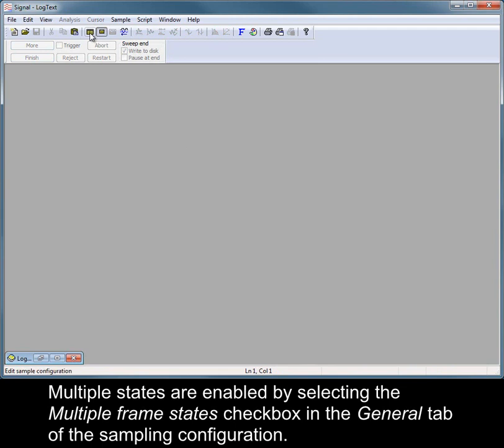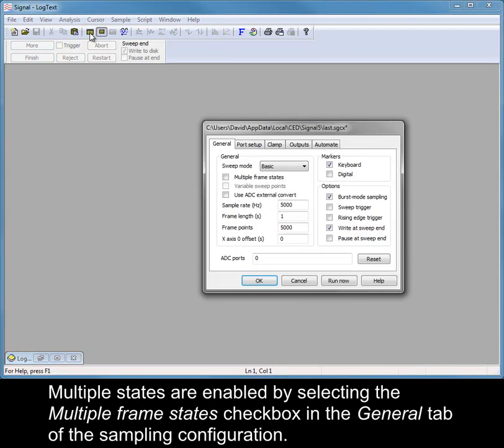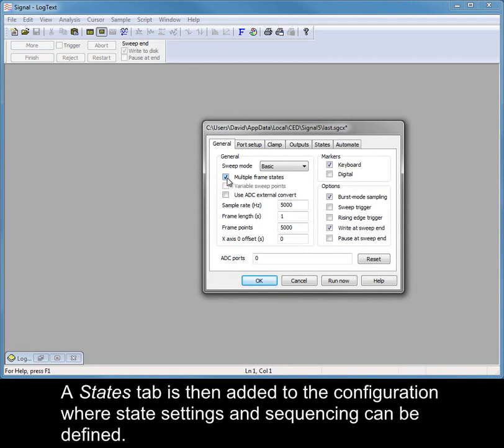Multiple states are enabled by selecting the multiple frame states checkbox in the general tab of the sampling configuration. A states tab is then added to the configuration where state settings and sequencing can be defined.